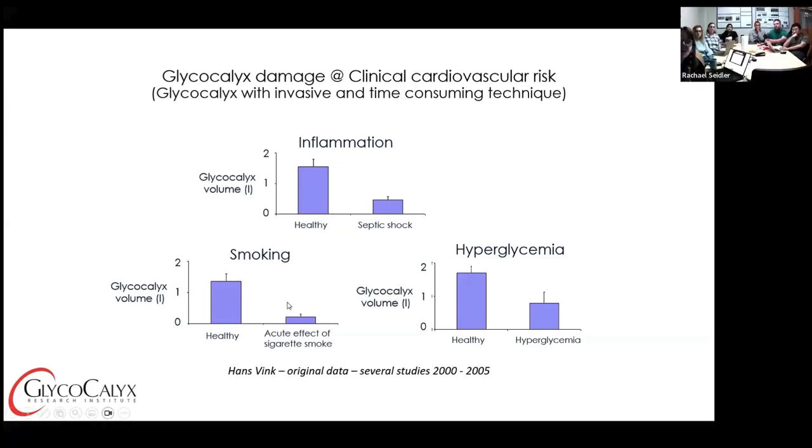Now, in addition to the... Hans, can I ask a question? I'm actually surprised how quickly you see this change. In a span of about an hour or so, or maybe you said 5 hours, how acute of changes can you measure? Well, it can be very acute. And it's very reversible also, so that's a good thing. We didn't destroy the health of these students.